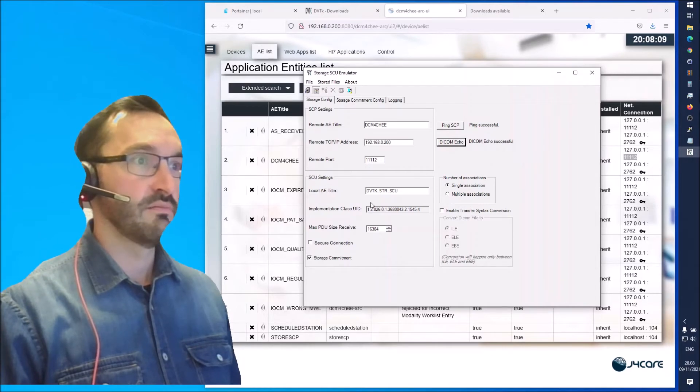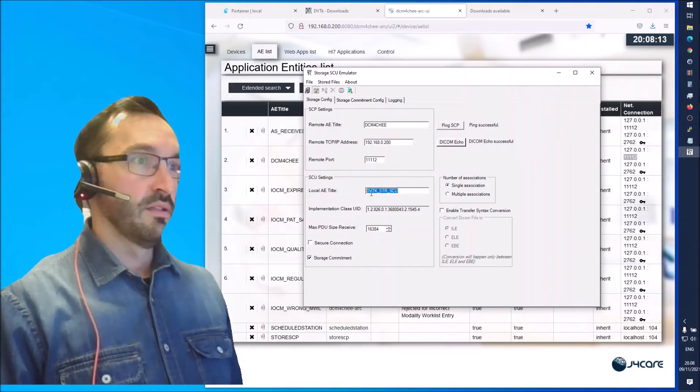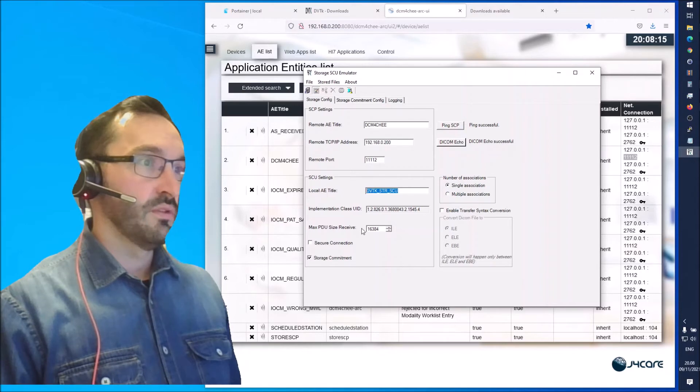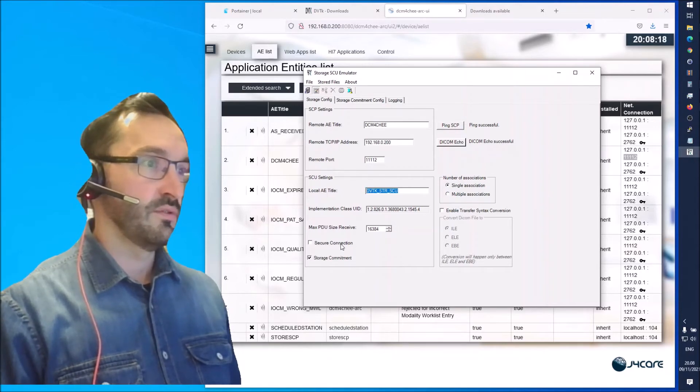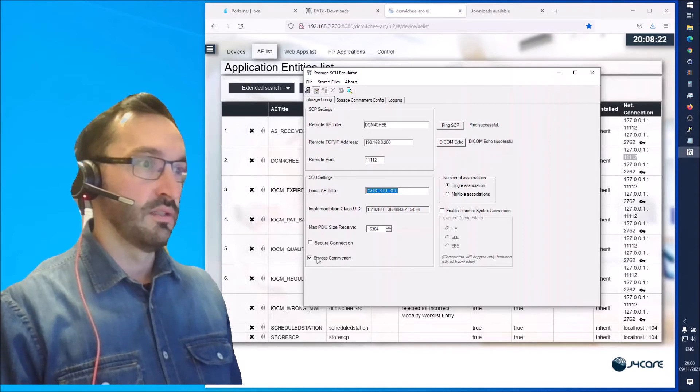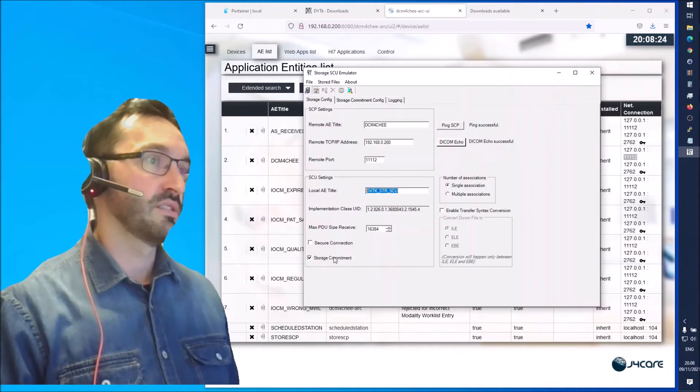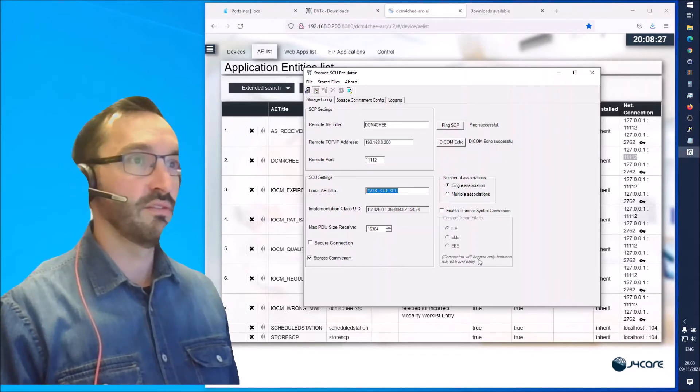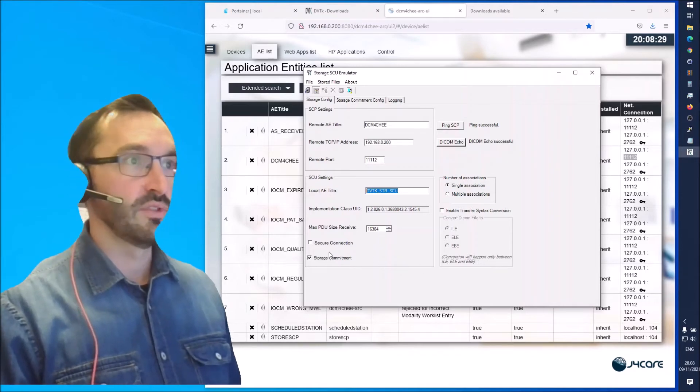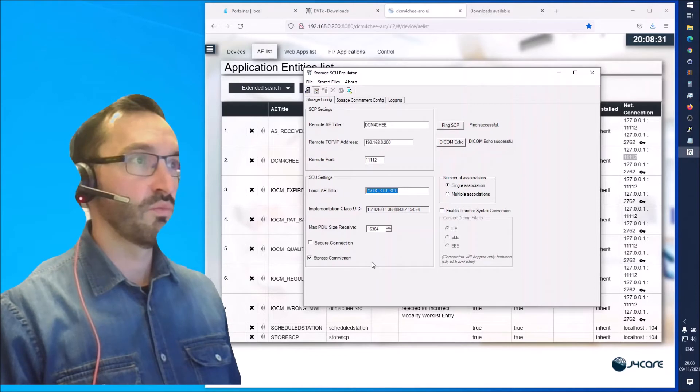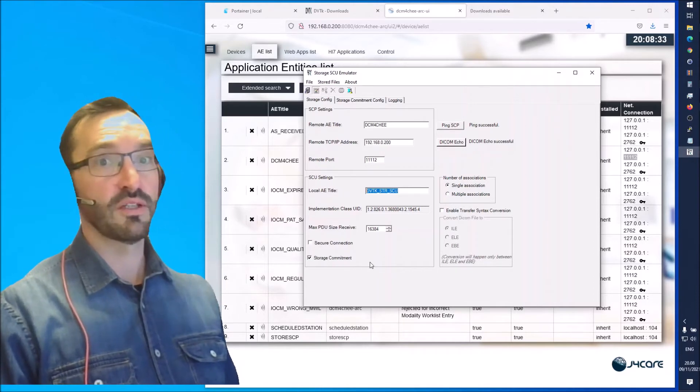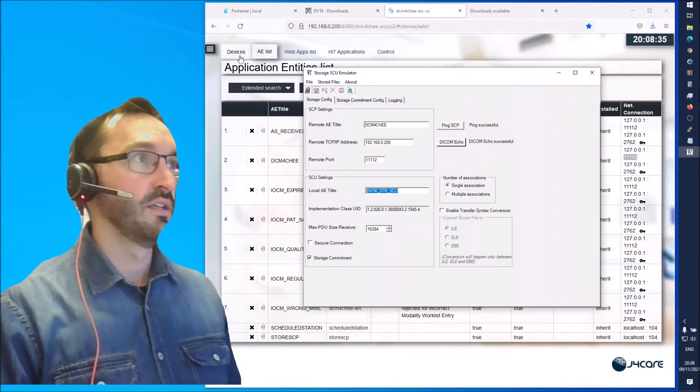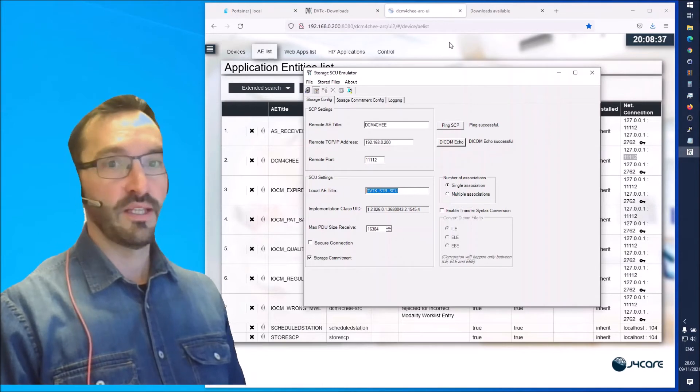Then we have the SCU setting. This is the modality side. We can leave this at the default. There is a secure connection option but let's not go into that now. Storage commitment is something you can disable or leave on. It doesn't really matter at this point. The main goal here is to get a DICOM study sent over to the Daikon4G VNA.